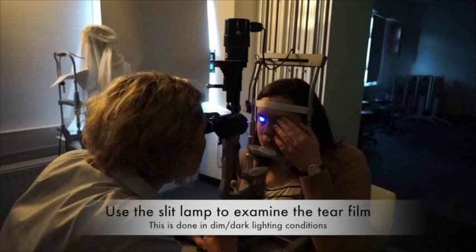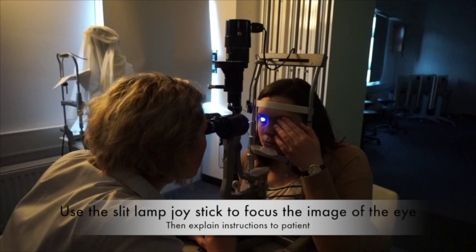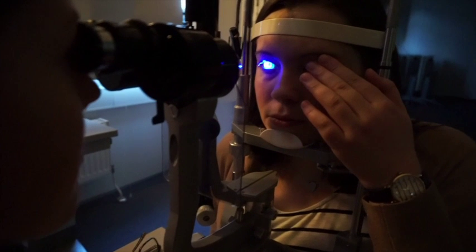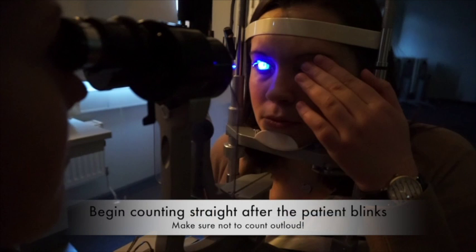Once the fluorescein has been applied, the patient is now ready to be examined by the slit lamp. The examination is done under dim lighting conditions to allow better view of the tear film. The orthoptist will commence by using the joystick to focus the image of one eye. Once the eye is focused, the patient will be asked to take one big blink, then hold their eye open for as long as they can and resist the urge to blink. The orthoptist will then observe the eye through the microscope while measuring the time in seconds it takes for the first appearance of a dark spot on the patient's cornea. Once the first dark spot is observed, the orthoptist will stop counting and record this as the TBUT result. To keep the patient relaxed, it is important not to count the seconds out loud.